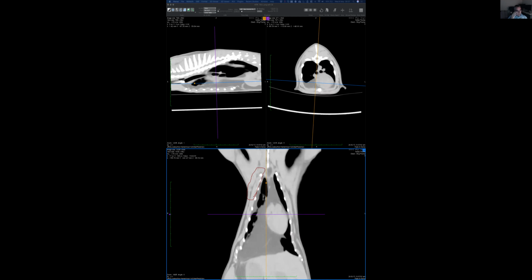Make sense? So the rule that we use, what we call border effacement, that makes the grapes disappear, was the situation where we have two structures with the same opacity, that's key, in contact, which is also key. Those two conditions are very important. If we have two structures with the same opacity, like two grapes, but they are not in contact, they superimpose, but we can still see them. If we have two structures with different opacity, like gas and grapes, we can still see contact.